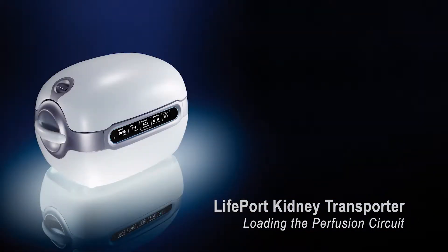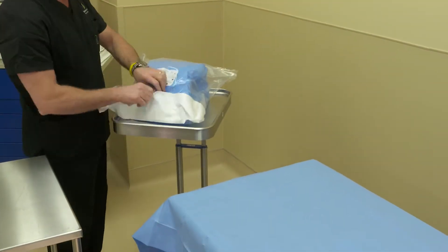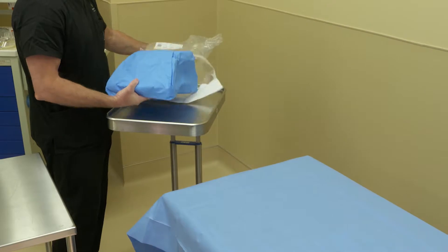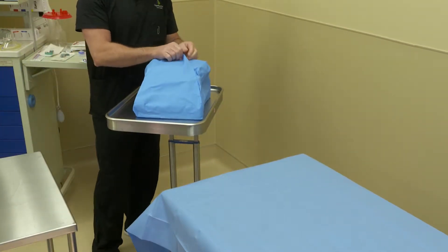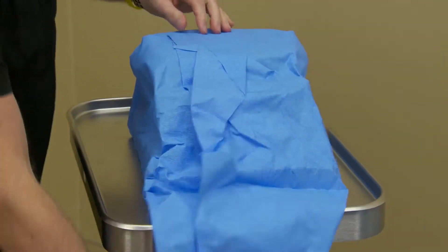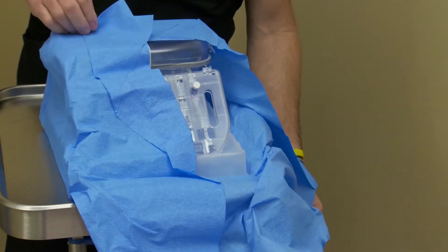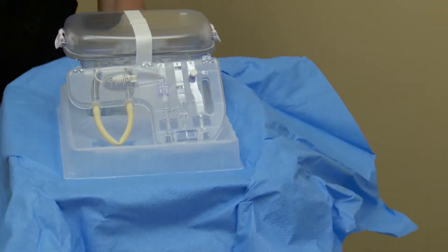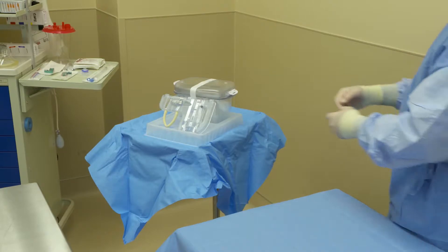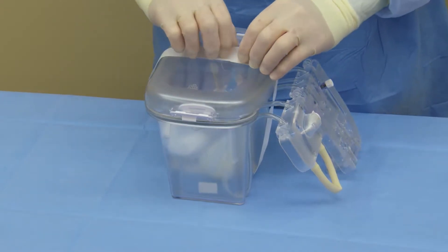Loading the Lifeport Kidney Transporter Perfusion Circuit. Remove the sterile perfusion circuit from its protective outer dust cover. Place the circuit either on a mayo stand or a back table, wherever is convenient, to open in a sterile fashion. A person who is part of the scrubbed-in team will then remove the perfusion circuit.